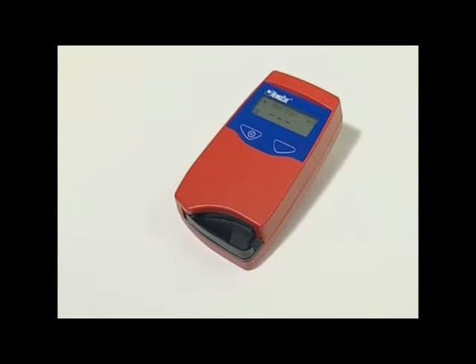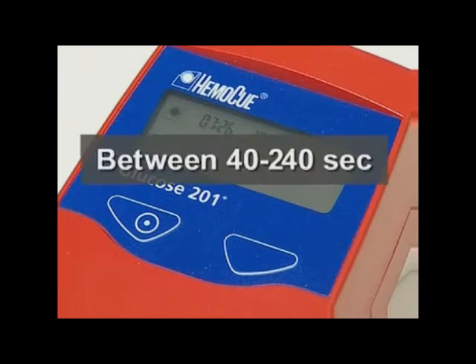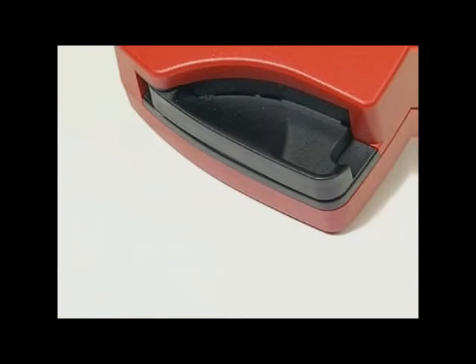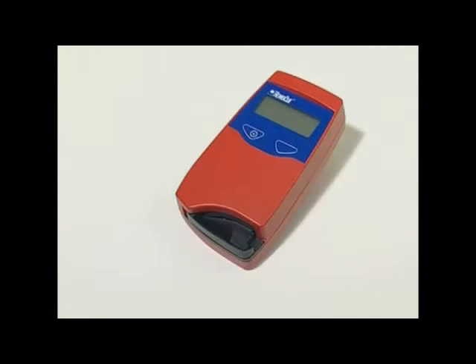During the measurement, an hourglass will be shown on the display. After between 40 and 240 seconds, the glucose value of the sample is displayed. The result will remain on the display as long as the cuvette holder is in the measuring position. When operating on battery power, if the analyzer is not used, it will automatically switch off after approximately five minutes.